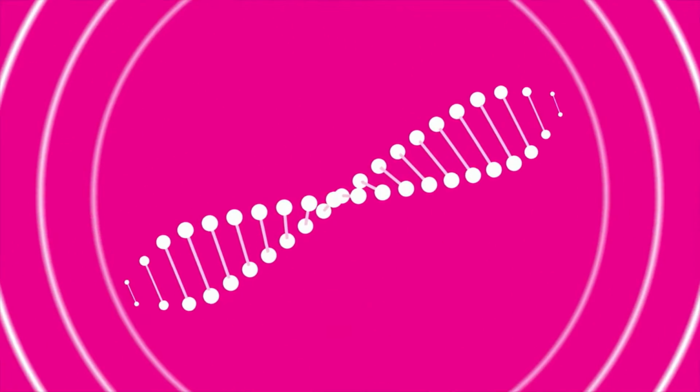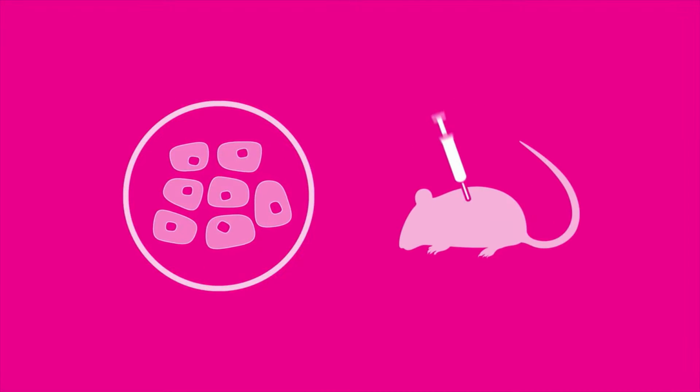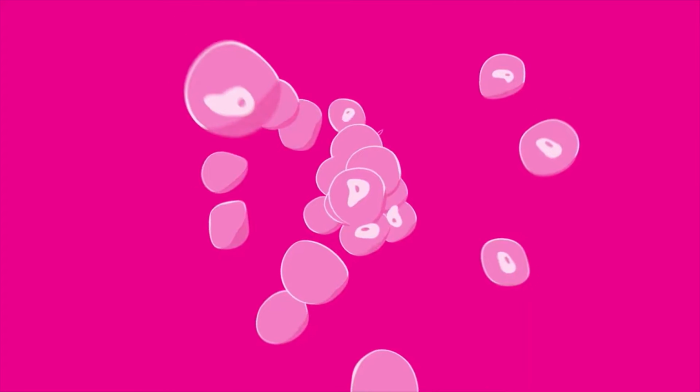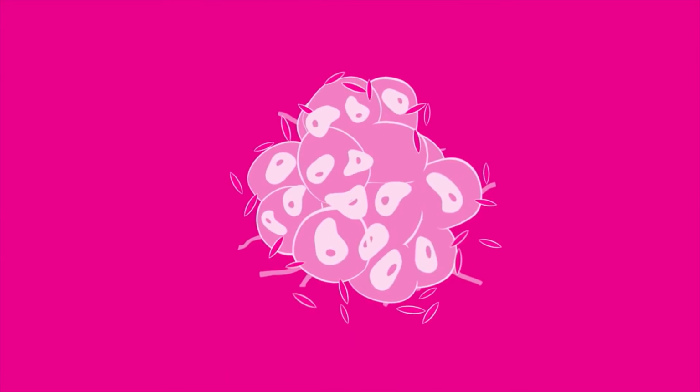Biomedical research and drug discovery have long relied on testing with cells on plastic or in animal models. Both often fail to predict what will happen in a patient. Today, 3D cell and organoid systems offer better models of human biology in the lab.